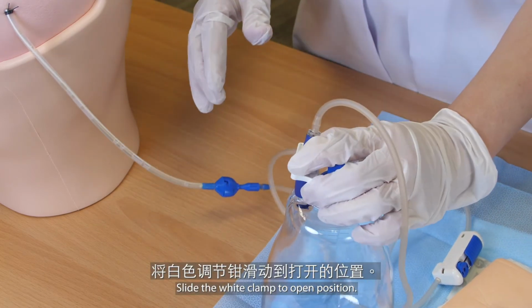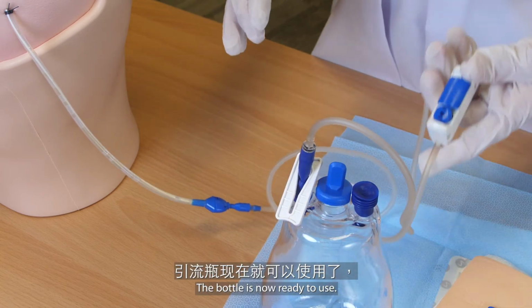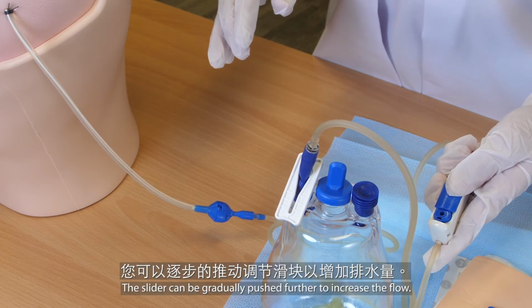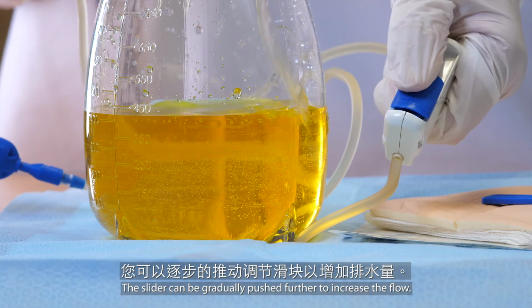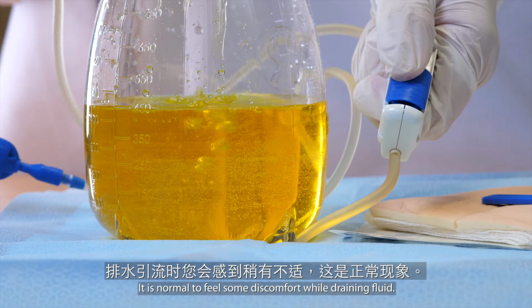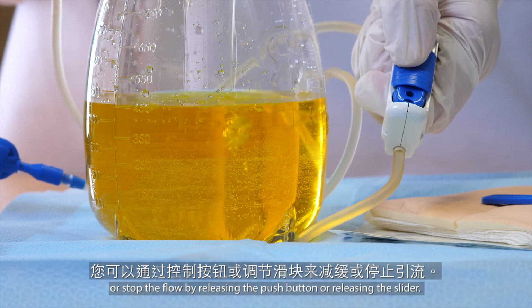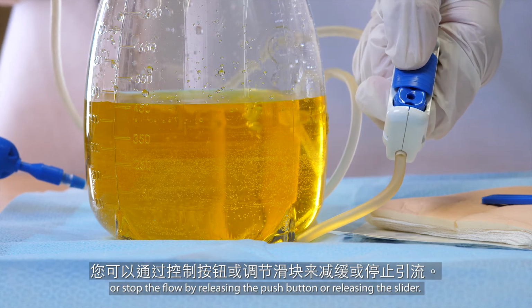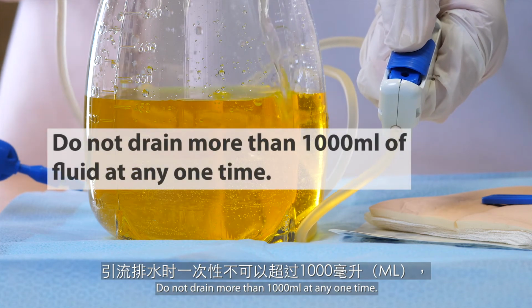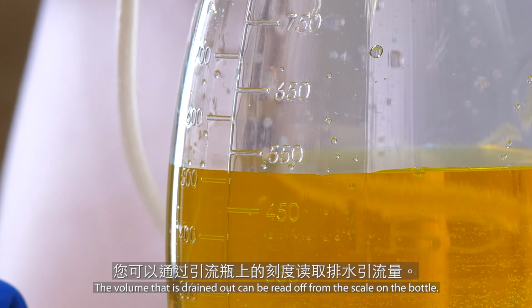Slide the white clamp to open position. The bottle is now ready to use. Slowly push the slider to start removing fluid. The slider can be gradually pushed further to increase the flow. It is normal to feel some discomfort while draining fluid. If you do feel pain or discomfort, you can slow down or stop the flow by releasing the push button or releasing the slider. Do not drain more than 1000 ml at any one time. The volume that is drained out can be read off from the scale on the bottle.